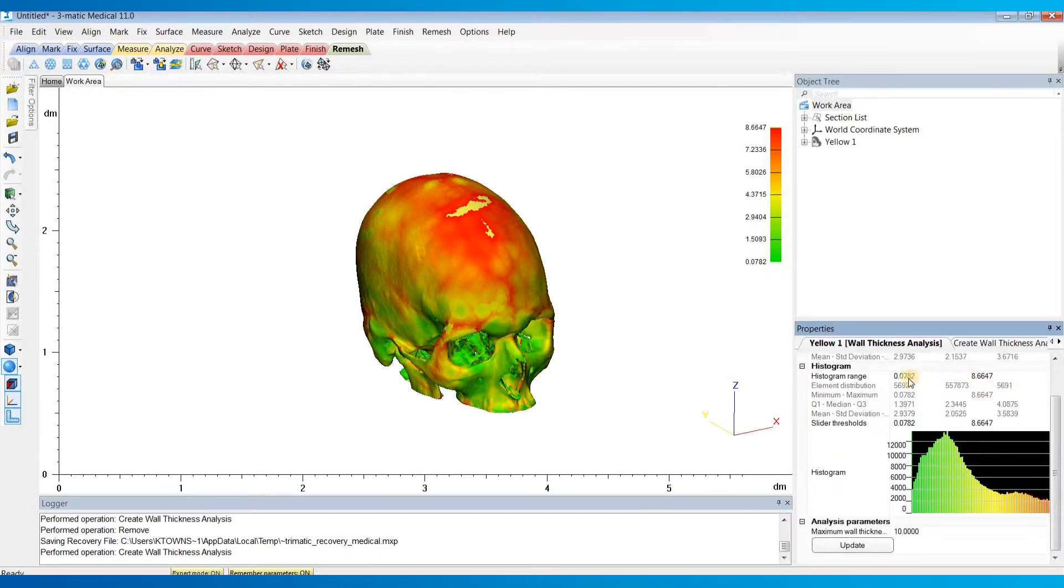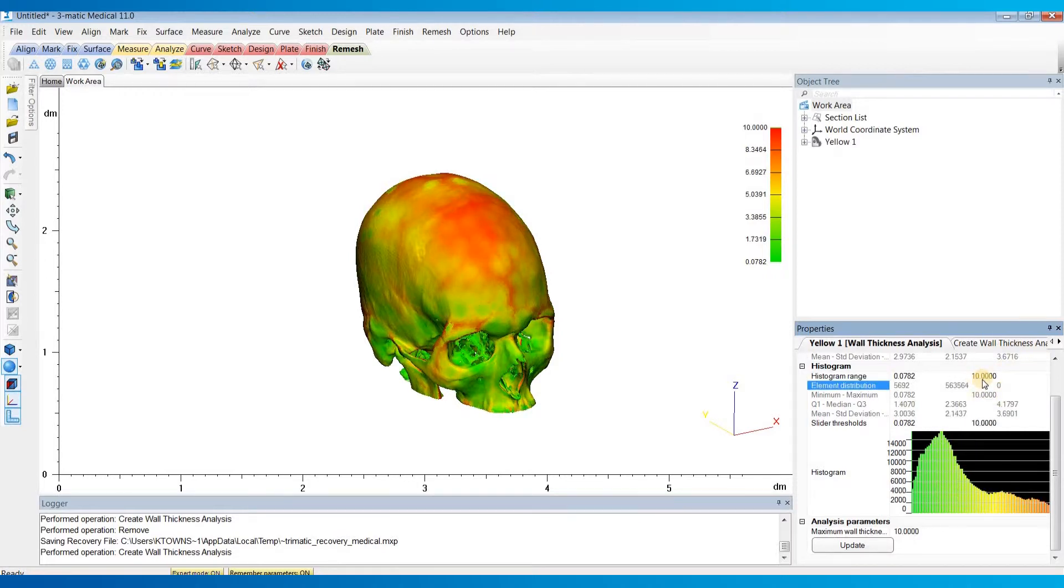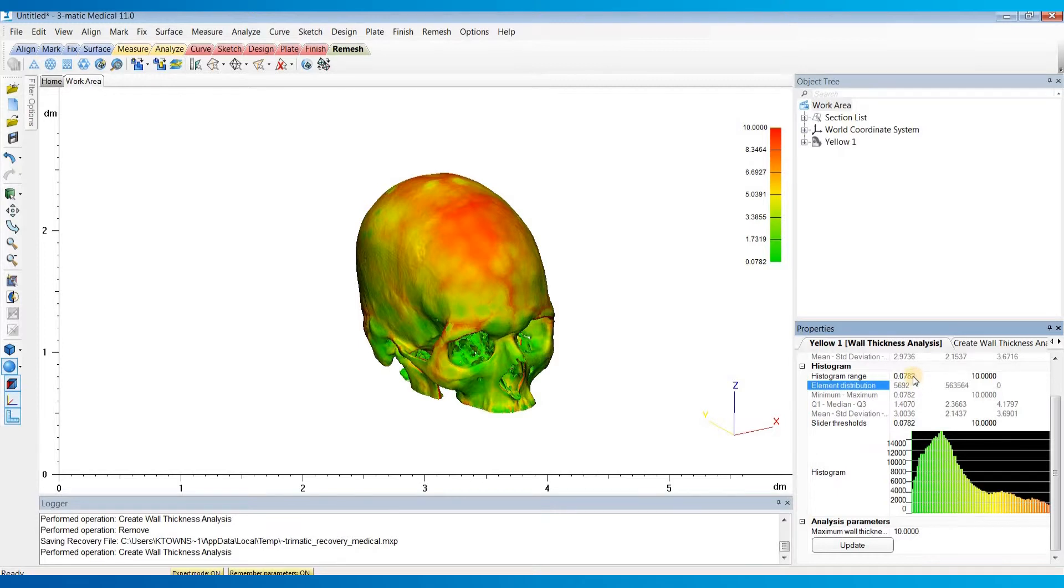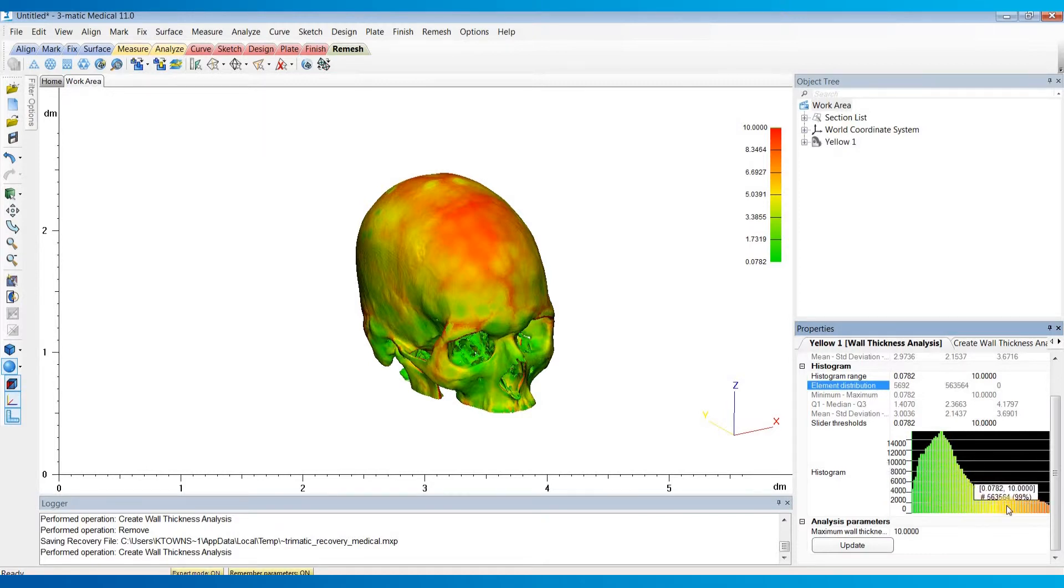And below that is our histogram. And so what I think it's doing is calculating the 95th or 98th percentile and setting that to the histogram maximum. So I'm just going to change that back up to 10. Below that is our element distribution. So this is the number of elements that are below the minimum value of our histogram range. This is the number of elements between our minimum and maximum values. And then this is the number of elements above our maximum values. So with that zero, I'm capturing and representing all of the elements. And then down here, you can see a visual representation of the histogram.